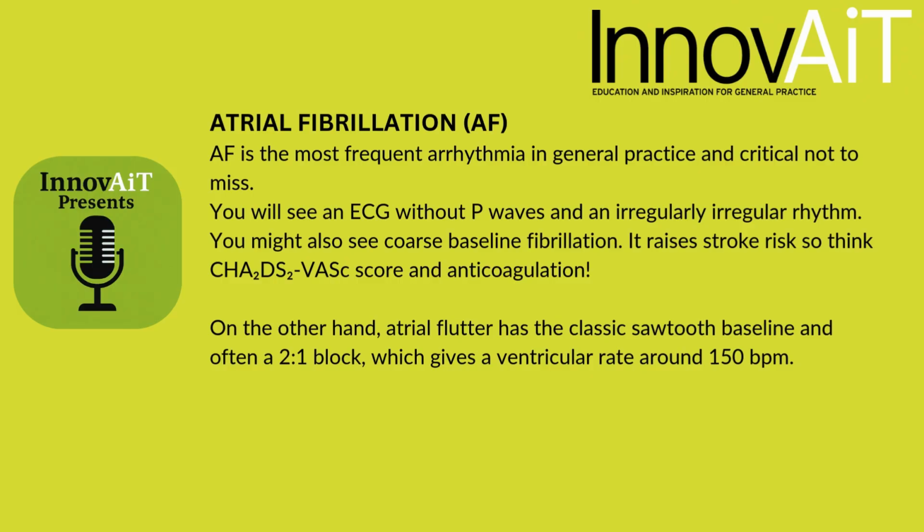It raises stroke risk, so think CHA2DS2-VASc score and anticoagulation. On the other hand, atrial flutter, which has the classic sawtooth baseline, and often a regular 2 to 1 block, which gives a ventricular rate around 150.